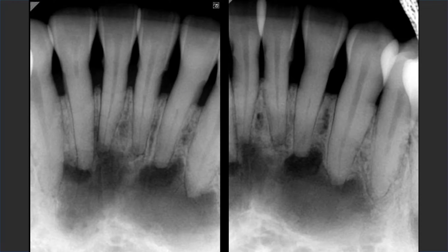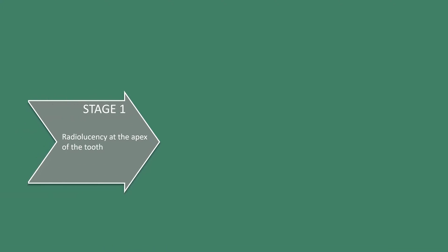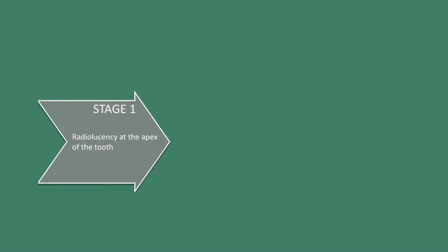If localized, this condition is known as periapical cementoosseous dysplasia. We'll use multiple images to determine if this can be classified as periapical or florid cementoosseous dysplasia. When the lesion is uniformly radiolucent, this is stage one of cementoosseous dysplasia — radiolucency at the apices of the involved teeth. In this stage it is very easy to confuse cementoosseous dysplasia with apical periodontitis, therefore vitality tests of the involved teeth are necessary.